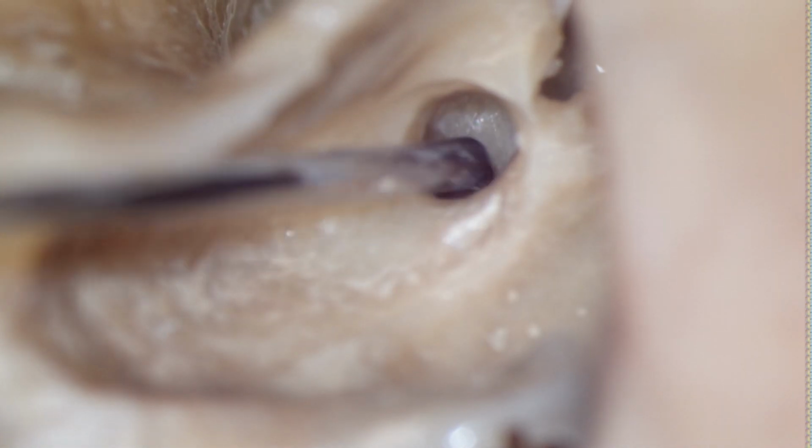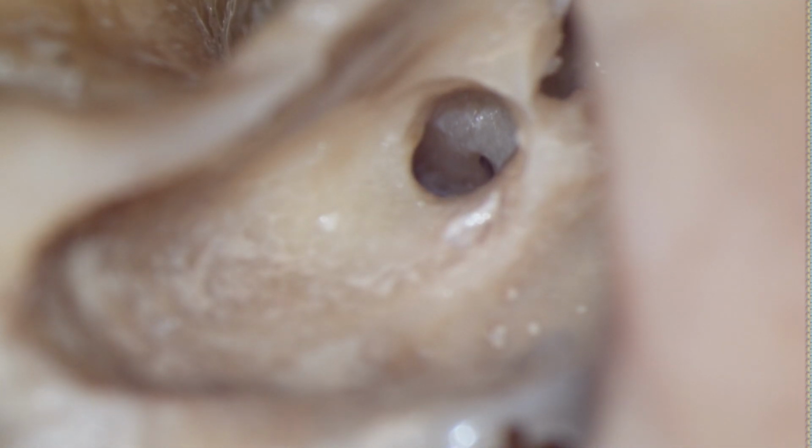Yes, it will be visible, we can do more. We can drill, so you can thin the posterior part of the posterior tympanotomy, right? So the posterior wall, you can drill it till the facial nerve actually, and it's a good idea to use a facial nerve monitor when you are doing a cochlear implant.